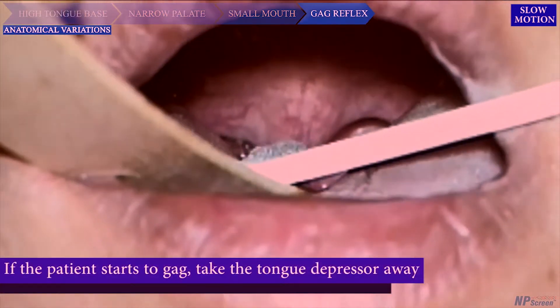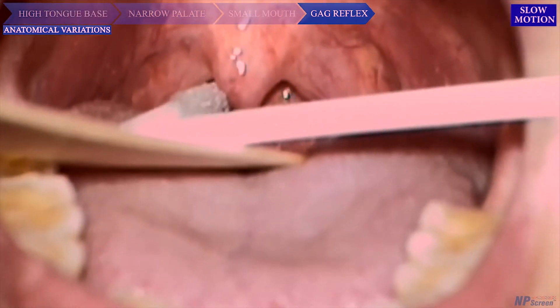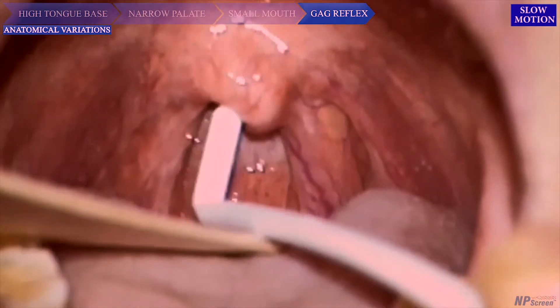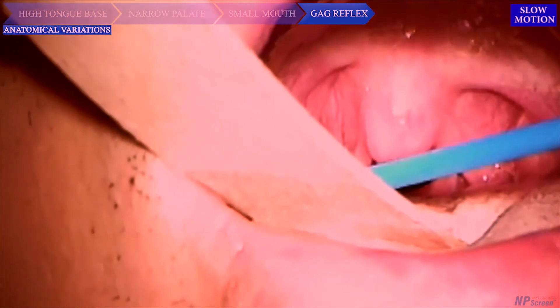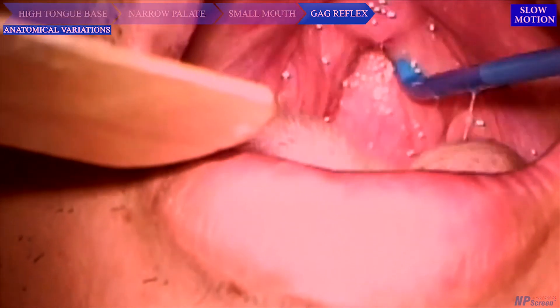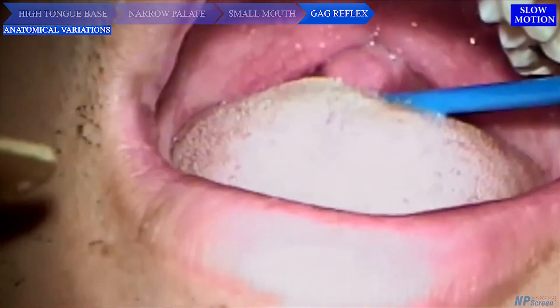Gag reflex: If the patient starts to gag, take the tongue depressor away from the tongue to minimize further gag reaction. When inserting the brush, place it more anteriorly closer to the soft palate, avoiding touching the back wall of the oropharynx to minimize the gag reflex. If the patient begins to gag continuously, have the patient rest for a few minutes before attempting to brush again. Interestingly, gagging can sometimes facilitate the brushing process, as it squeezes the nasopharyngeal wall together, allowing the brush to collect cells including both sides of the fossa of Rosenmüller.